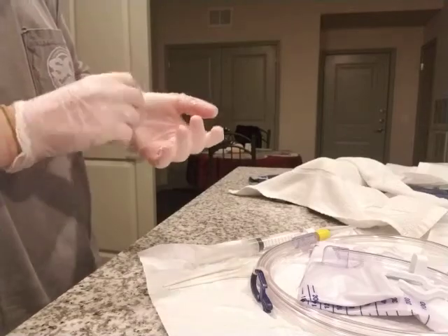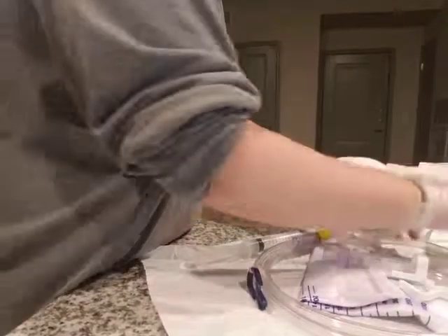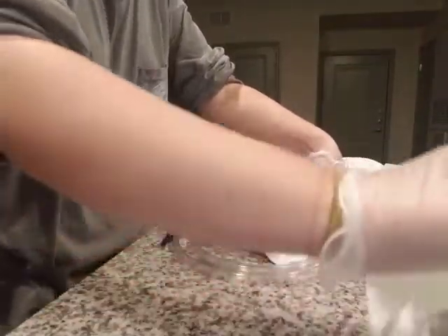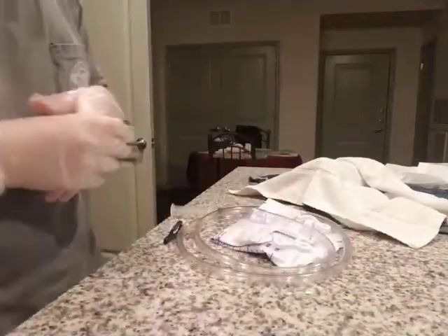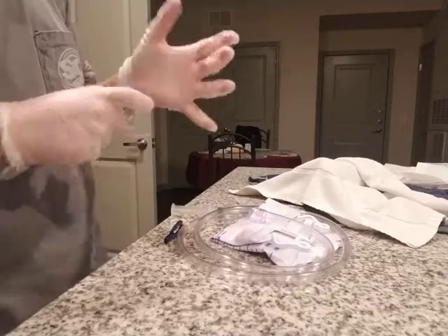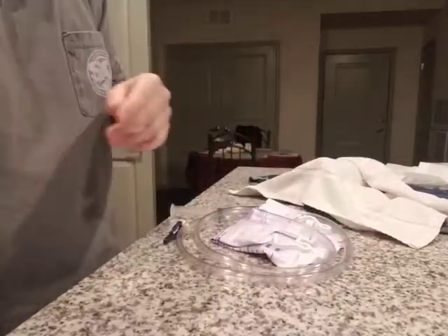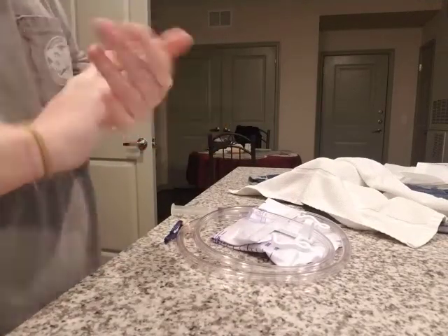And then I'm going to remove all of my equipment. Not this. And then I'm going to place that into the appropriate trash can. And then I'm going to remove my gloves and perform hand hygiene.